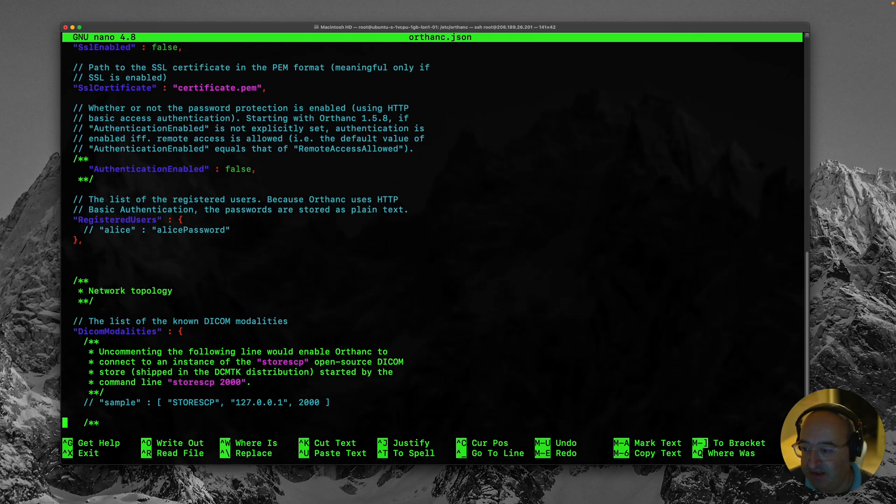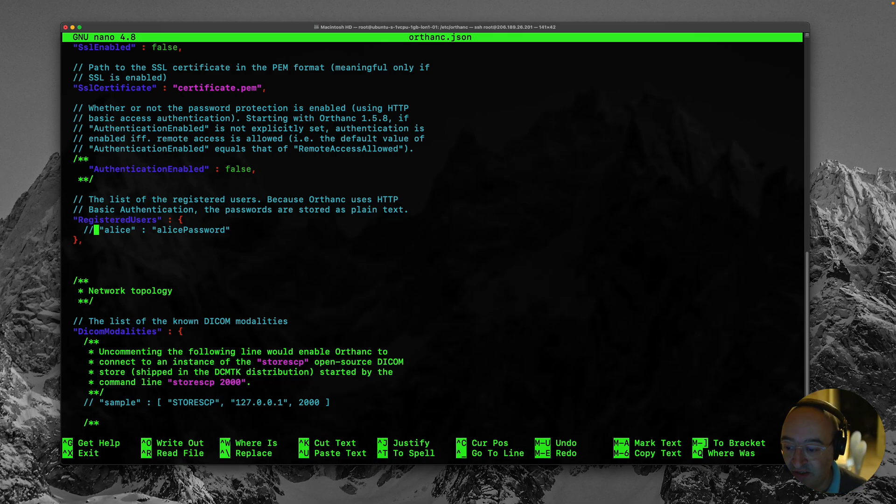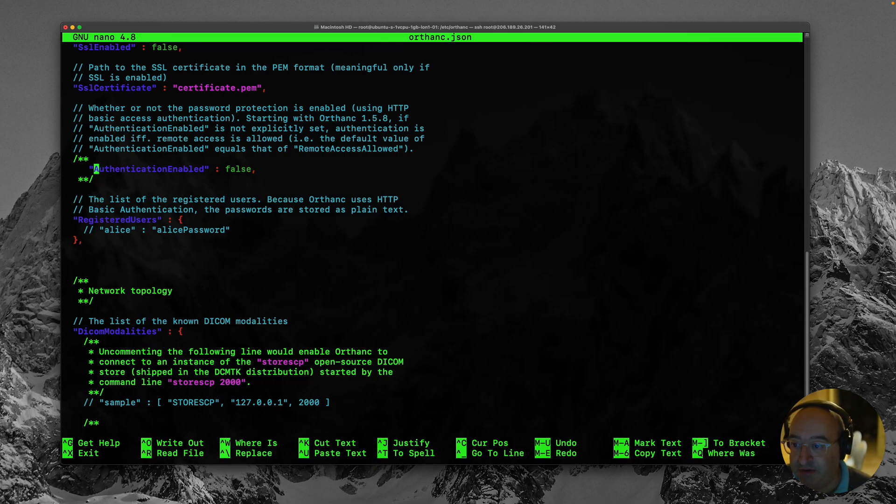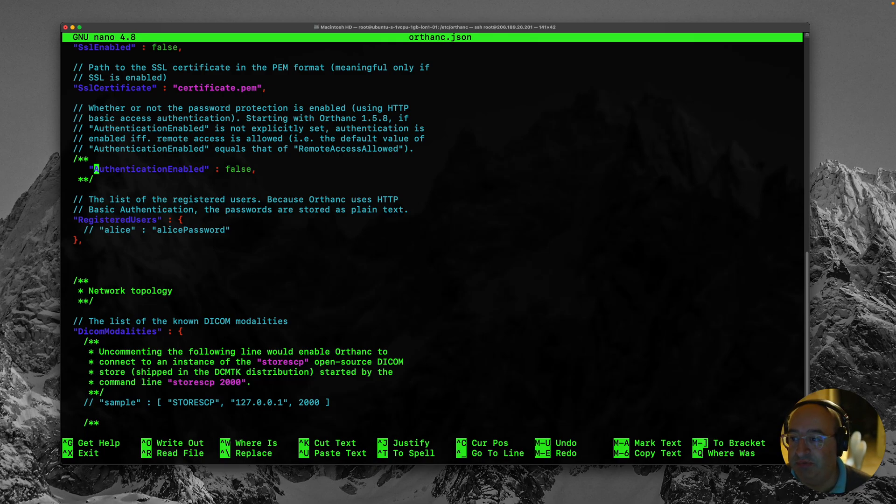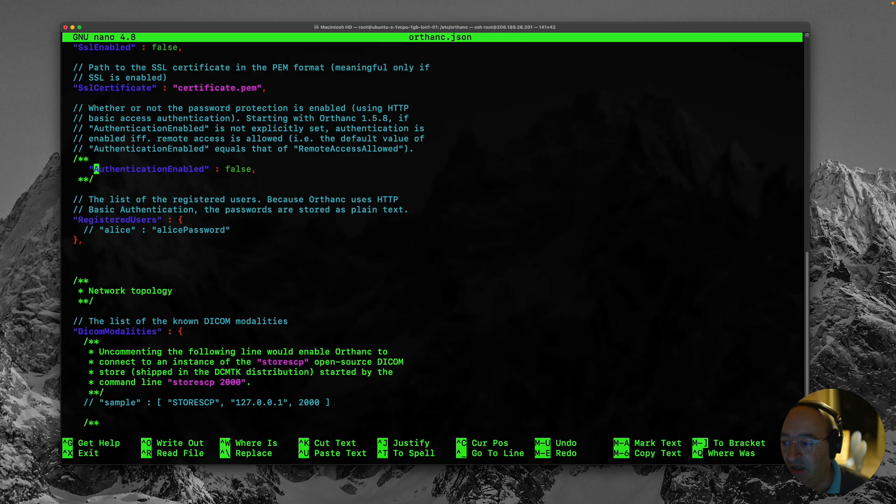Oh here we go. What's this? Registered users. And we can see it's actually commented out. So as we thought there are no users. So you would never be able to get into it at the moment. And it says authentication enabled false. Which implies that I wouldn't be allowed to get in there. Even if there was a user.